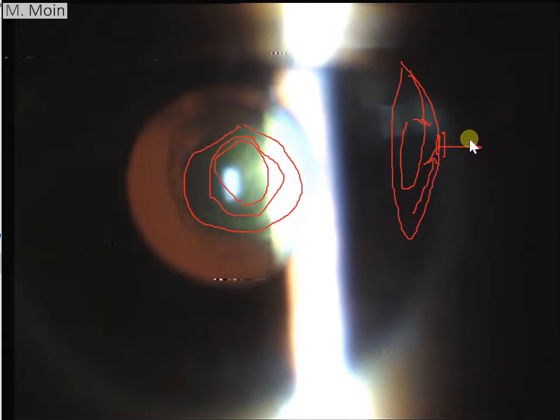As you do hydro dissection or anything there's a rent and the nucleus falls back immediately behind, but even if you don't have that you need to do limited hydro dissection in these patients.